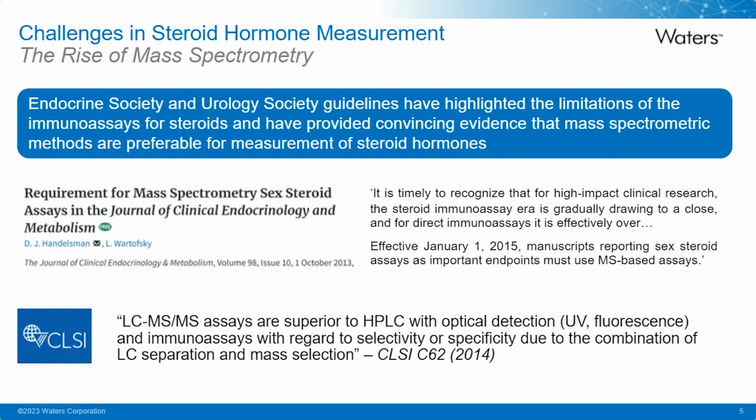However, based on the growing use of LC-MS in clinical laboratories in 2014, CLSI released an approved guideline on the use and the implementation of LC-MS methods in clinical labs. And within that, they state that LC-MS assays are superior with regard to selectivity due to combination of the LC separation and mass selection.